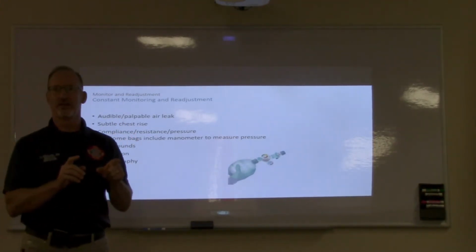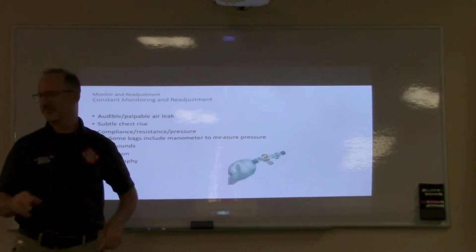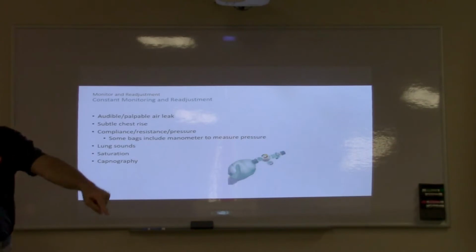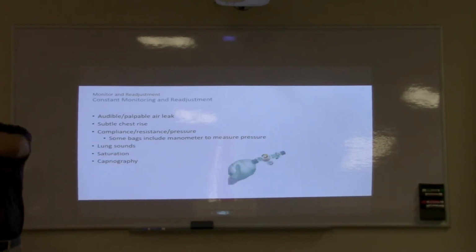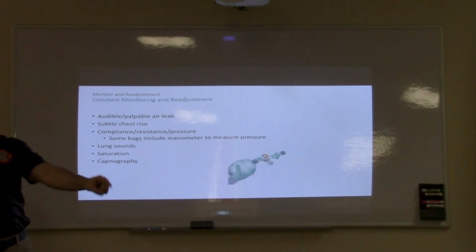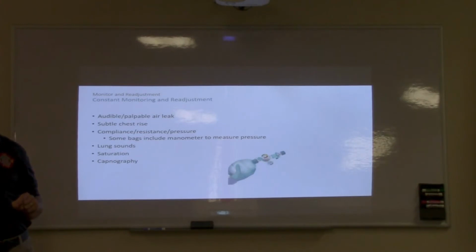The only thing I can think of is if you're having difficulty getting to the patient, like if a patient is on the bed. I'm going to say the patient drops right here, right now. All of us in the room, we have all the ALS equipment sitting right here. Who am I going to put a non-rebreather on, and who am I going to bag?